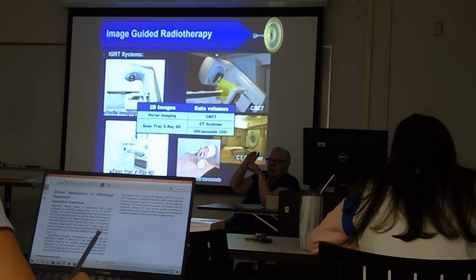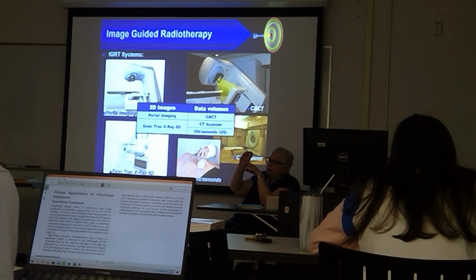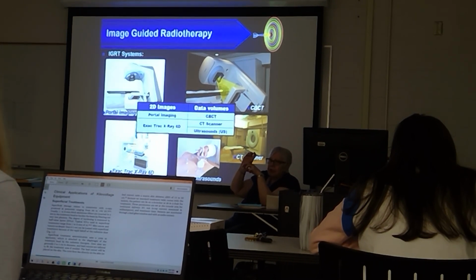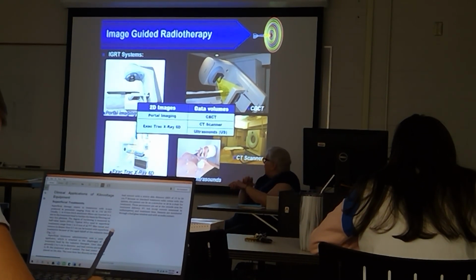So you have this bladder edge which sits along the prostate. So if you get the bladder ultrasounded, then you can see the edge of the prostate sitting there.